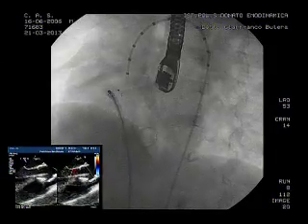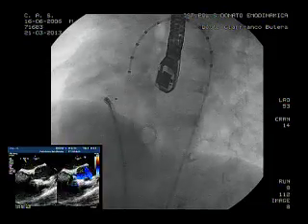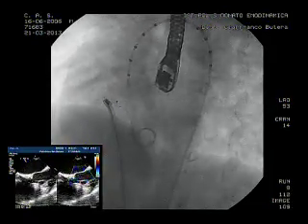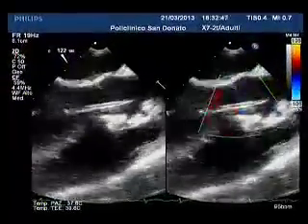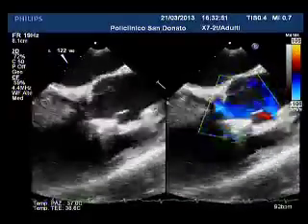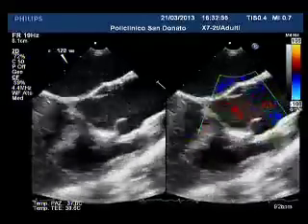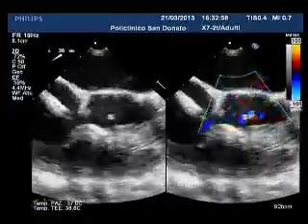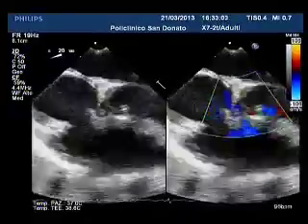Ahi, big echo picture first. Can you zoom a little more, Z? Yes, we can zoom for you. Because it's a small device. So there is the zooming there. Yep. I'll do a cine for you. There you go. So I think it looks good to me. Let me go just one more view to the 30 degrees. Ahi is going to do echo. Show them the echo here, big picture. That looks good. I'm pretty happy with this.